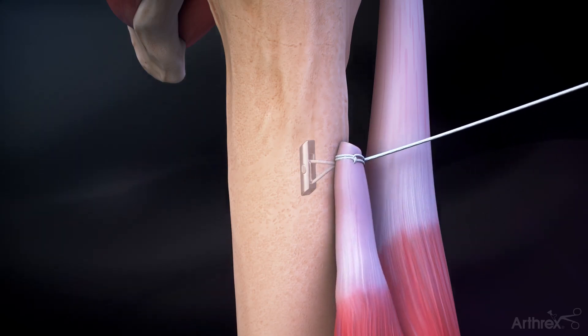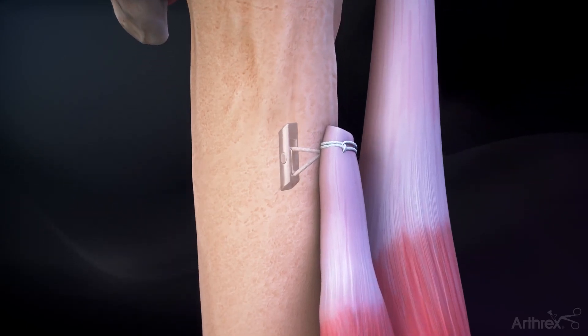Pull on the free suture limb to reduce the tendon onto the bone. Cut the excess suture to complete the tenodesis.